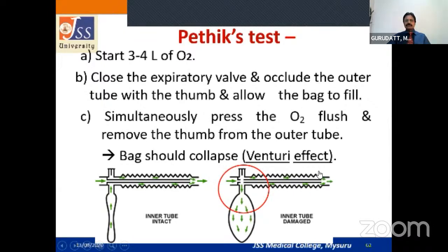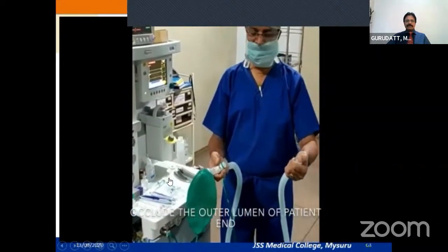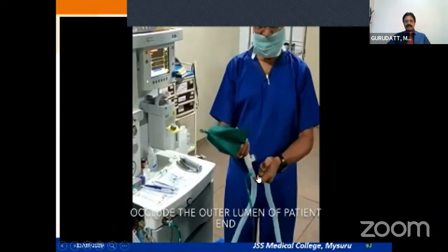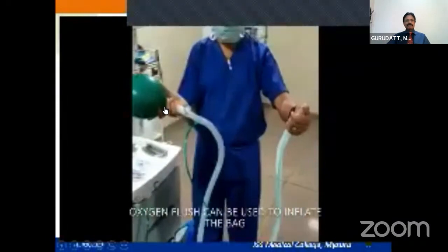So just let me show you this particular test. Then you have to close the APL valve and also close the outer end of the circuit. For this, you can also use the opening of the outer tube. I've closed the expiratory valve, I've used the flush, and the APL valve is closed.